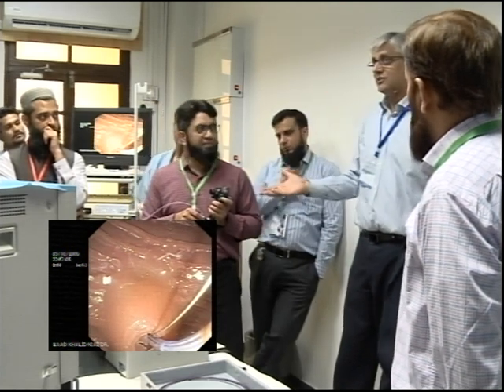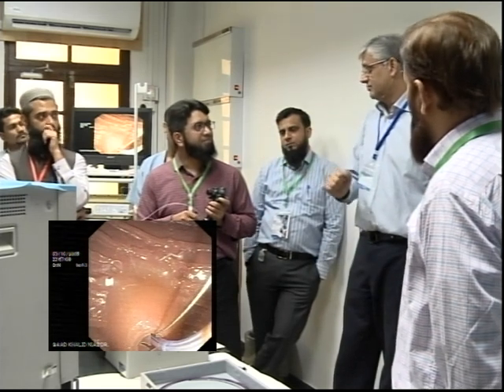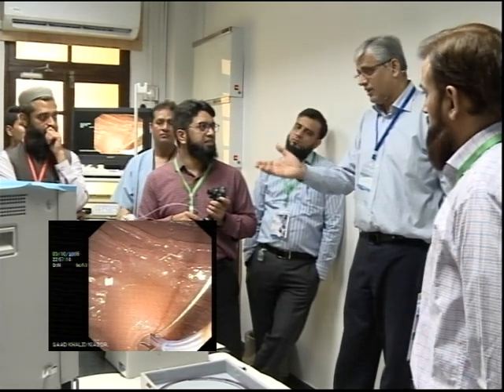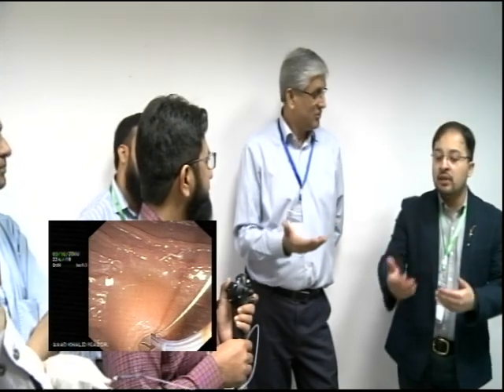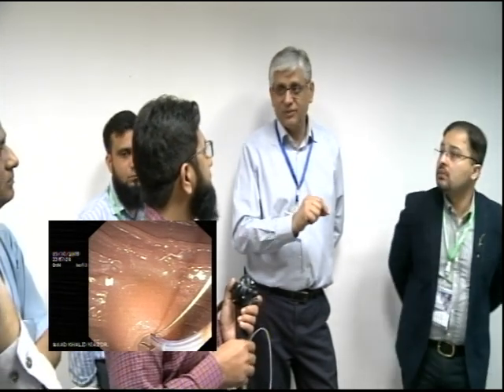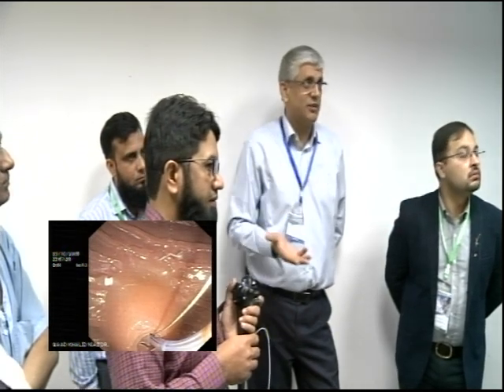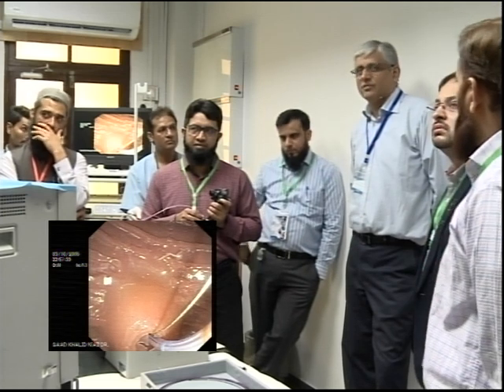I'll say, bhai, mujhe ye batao, tumne kitni dafa pancreatic duct cannulate kiya? What was your cannulation time? Because that's directly proportional. Yes, one of the factors is how much time you take. So I think there are a lot of variables in acute pancreatitis following ERCP, but giving Voltaren is a pretty simple thing to do. Not in all cases, but that's what we do.